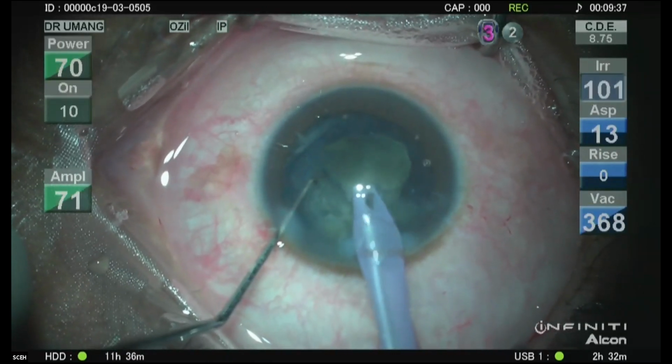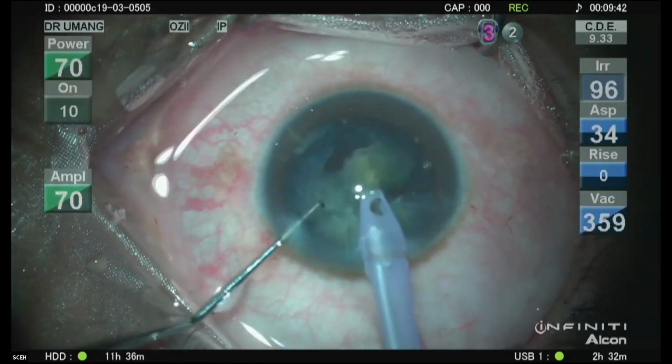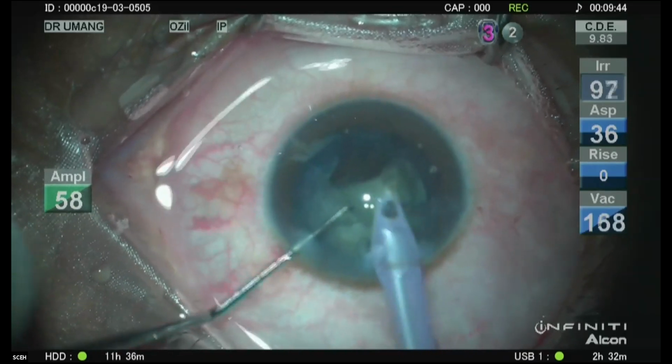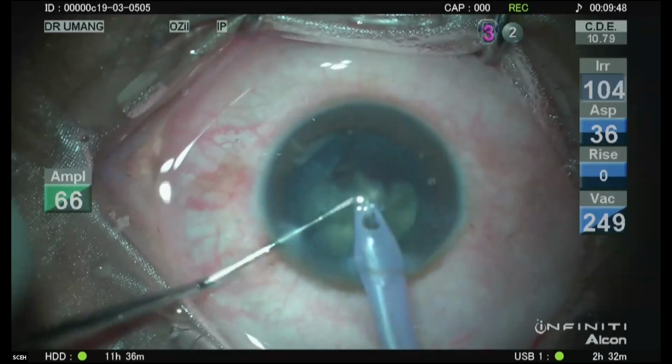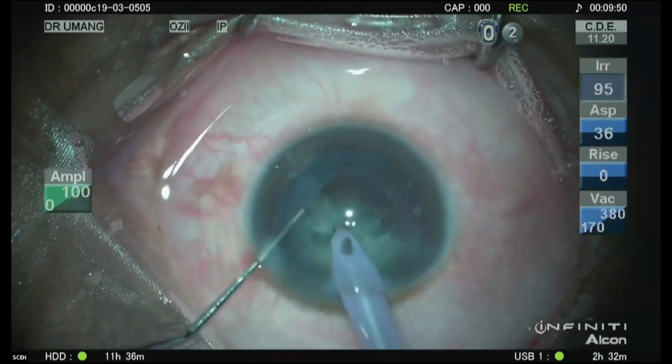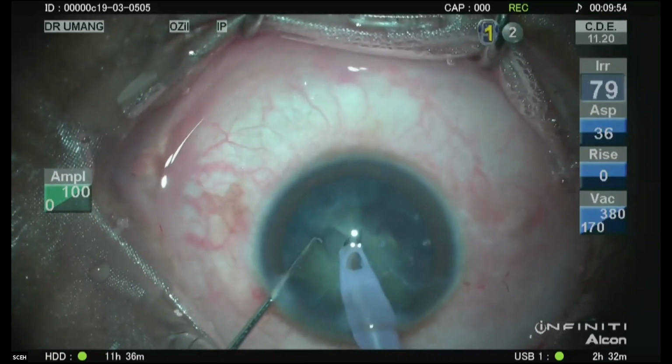So it gives a burst of longitudinal. So the piece, and as you notice, the probe remains quite in the center. I don't have to go searching for the piece except when I want to get it out of the bag.